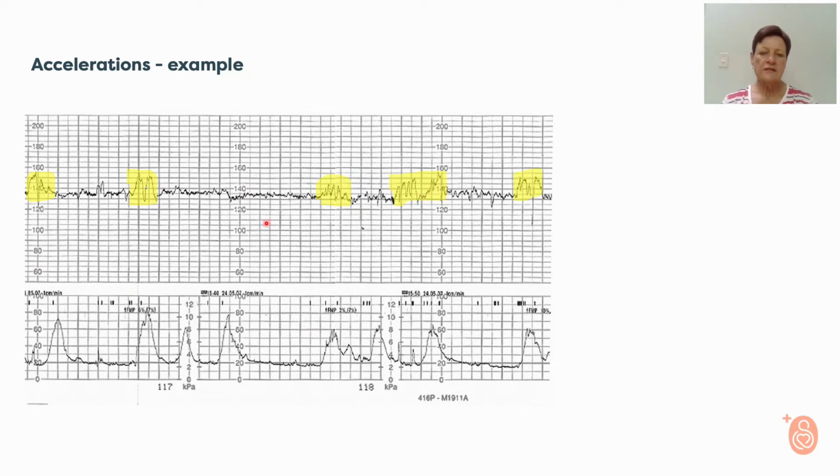Now, if we look at the duration here, remember we've said when we want to determine the duration of anything, we need to first of all look at the speed of how fast the paper has gone through the machine, and it should be set here. It might be a little bit small for you to see, but it's 1 centimeter per minute.